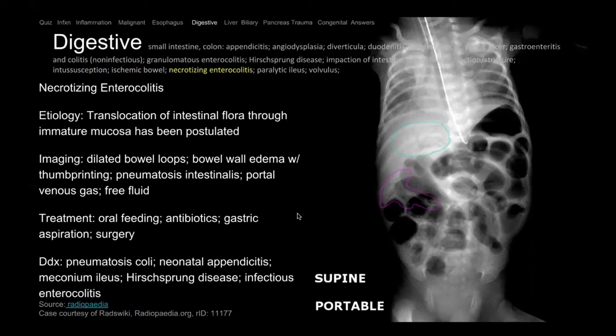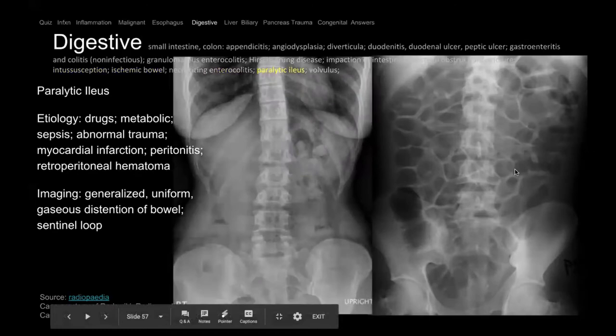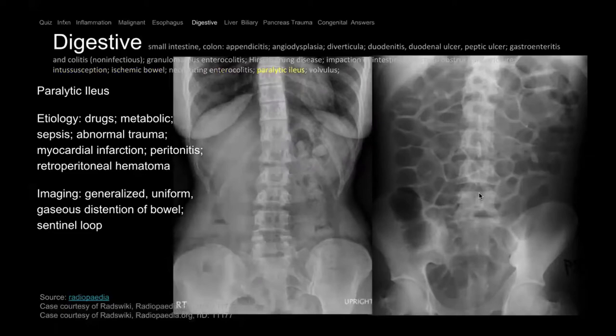Paralytic ileus — you can have adynamic ileus where the bowel's not moving very much, so all the air the patient swallows stays put. Here there's diffuse bowel gas involving all segments of the bowel — that's different from a normal bowel gas pattern. This happens in patients on narcotics for pain, patients who are postoperative and haven't returned to bowel function, or really sick patients with poor bowel motility.